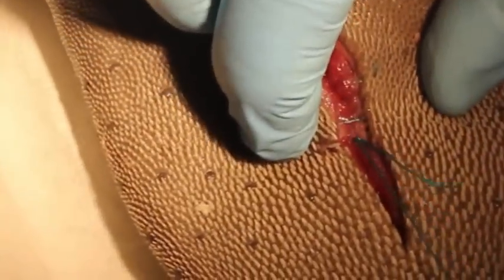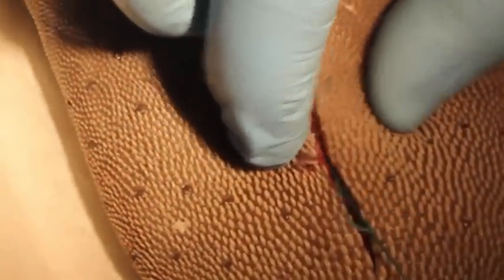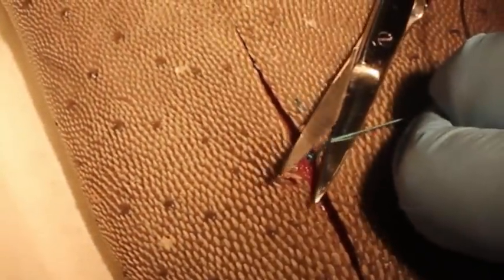Now you can see when I cut it — the knot is at the bottom. We pull right over the skin, we cut, and the knot is underneath, and we close.